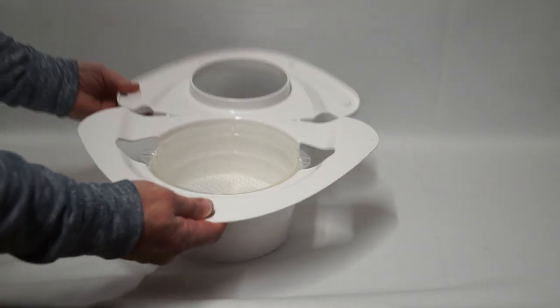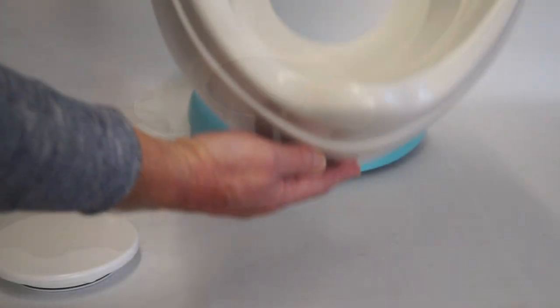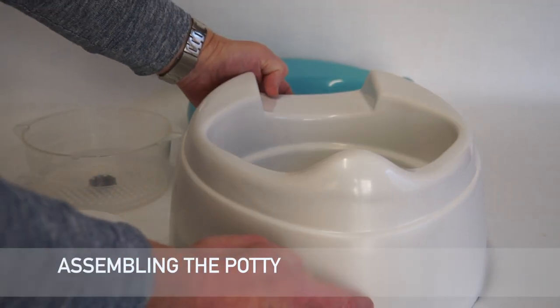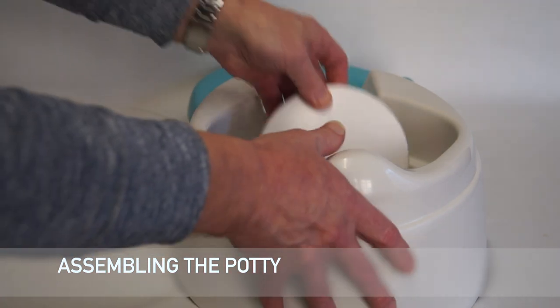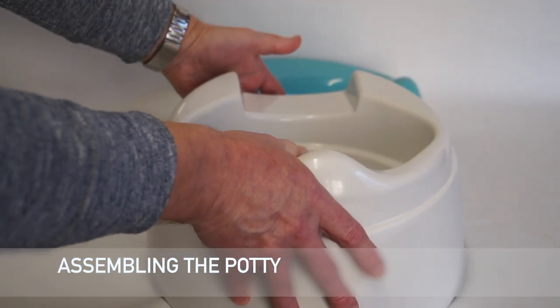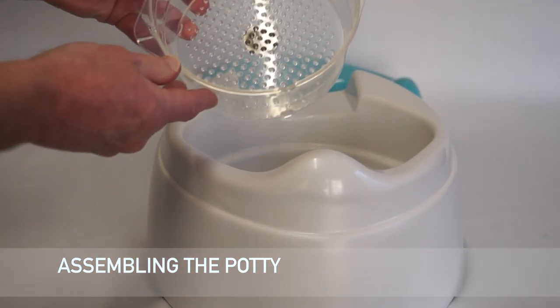The system is easily adapted to work with young children who use a potty. Simply insert the Uroflow meter into the base of the potty, add the clear Homeflow cup, place the top cover onto the potty, and it is ready to be used.